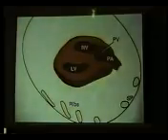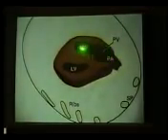Then we have the pulmonary artery. The pulmonary artery arises from the right ventricle, and again the pulmonary artery will also have a valve, the pulmonary valve. So if you focus on the right ventricle, you must see the gradual course of the pulmonary artery, and that's what we are going to show you in a minute.